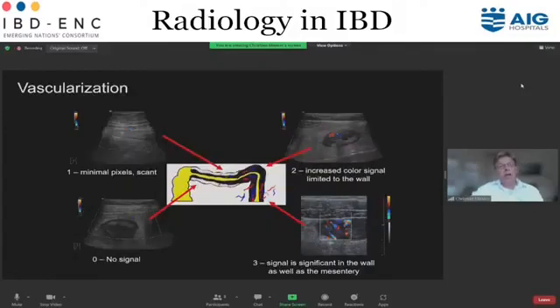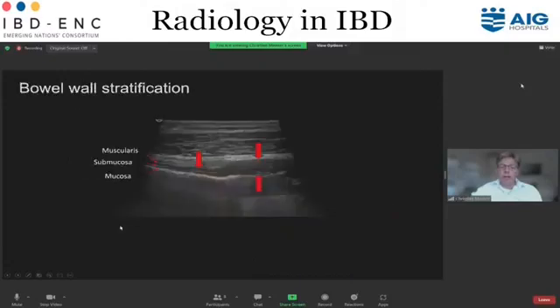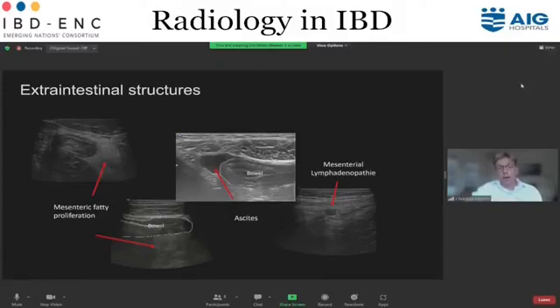You can also look for vascularization: lots of vascularization means lots of inflammation; no vascularization means less inflammation and more fibrosis. Next, bowel wall stratification — you see the air in the lumen, the bright line, then mucosa, submucosa, muscularis — three layers. Looking toward the right, there is no stratification anymore. Beyond the bowel wall, the most important parameter is mesenteric fatty proliferation, a sign of inflammation that also helps you find the inflamed bowel, surrounded by this whitish proliferation.